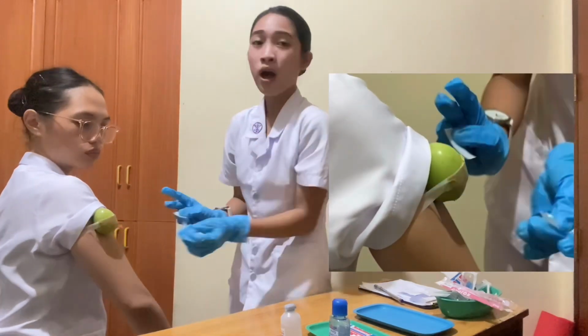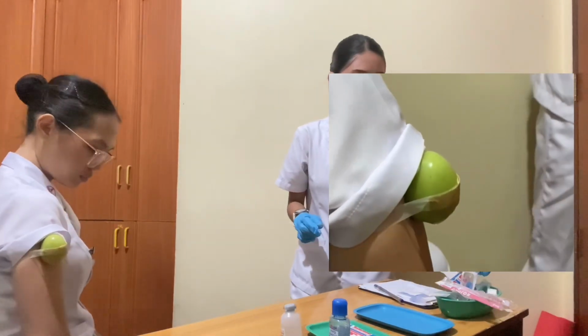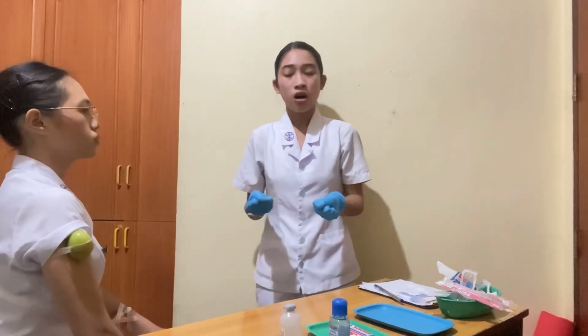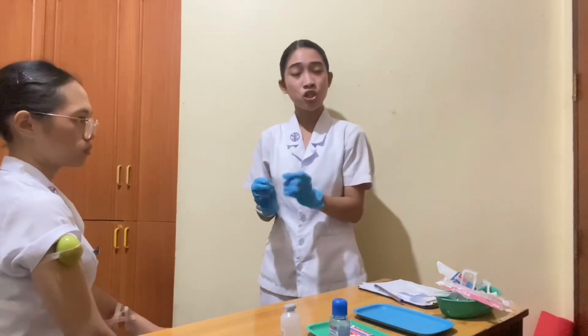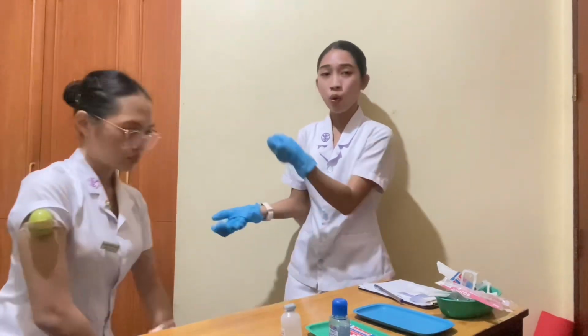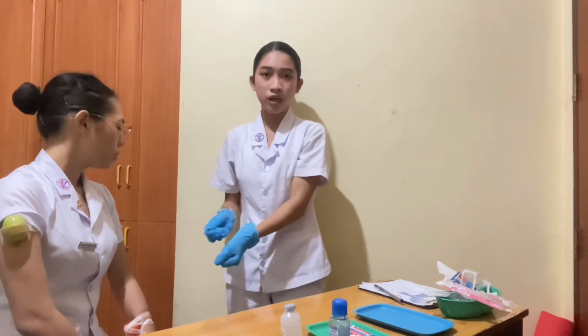Again, remember to put a band-aid so that it will stop the bleeding of the injection site of the patient. Remember to put also on the subcutaneous area.